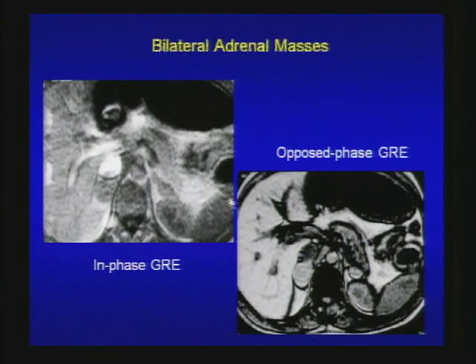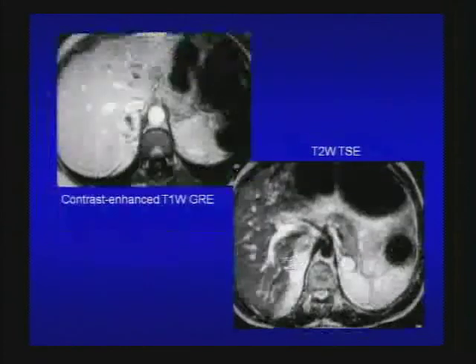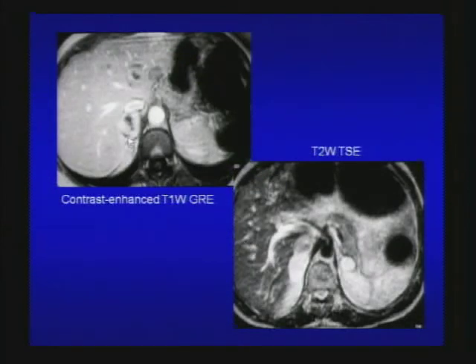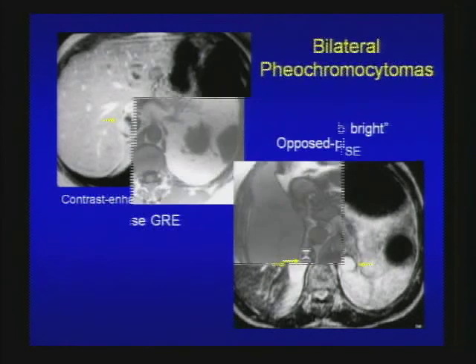Another case of bilateral masses. No significant signal drop on opposed-phase image compared to the spleen — not typical for adenoma. On contrast-enhanced MR, heterogeneous enhancement and very bright on T2-weighted images — light bulb bright. This is a case of bilateral pheochromocytoma.